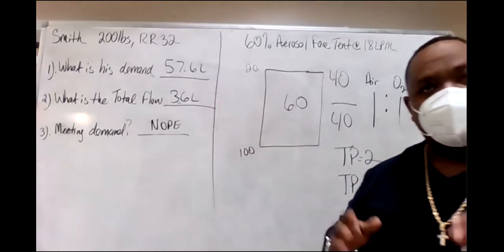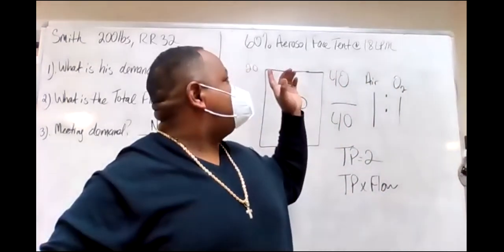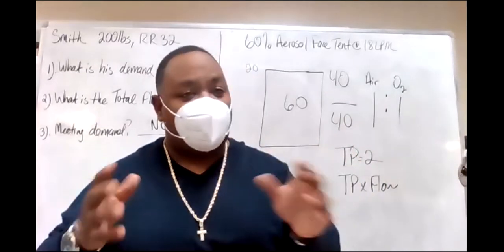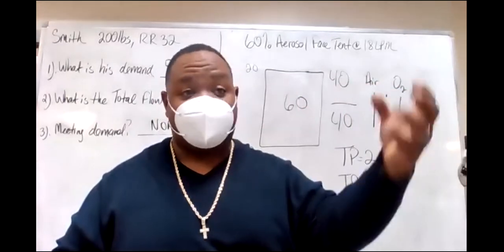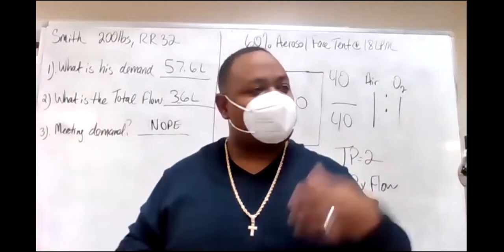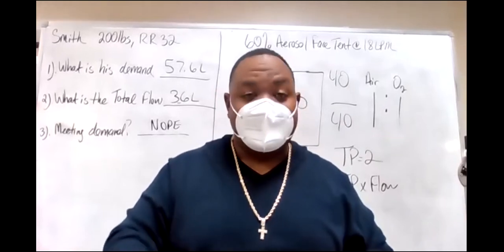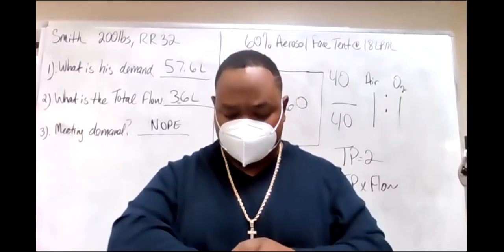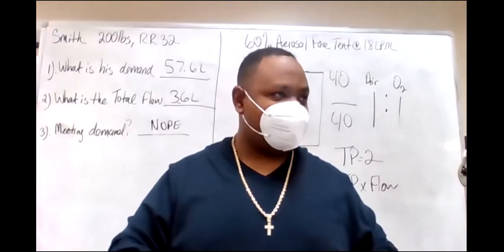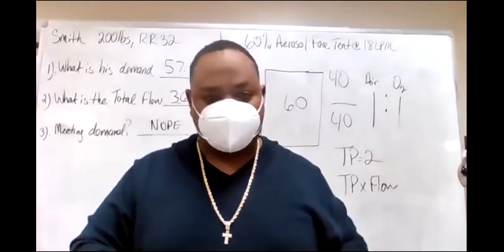Now, we're gonna take a break, and when we come back from break, we're going to show you these devices. I'm gonna show you a 60% aerosol face tent or aerosol T-piece or whatever. It's not as hard as you think. It's all about what's on the end. Whatever's on the end, that's what you call it. Whether it's a trach collar, an aerosol mask, a face tent, a T-piece, whatever's on the end is what you call it, okay? All right, let's take a break. It is 3:55. Let's come back at 4:10. Have a 15-minute break. Come back at 4:10, and we're going to get on into the lesson.